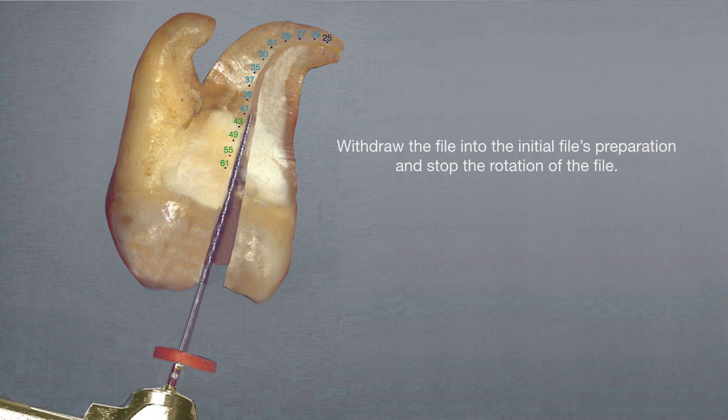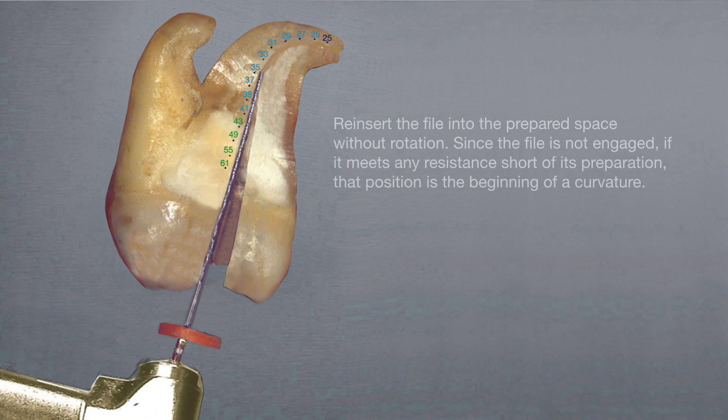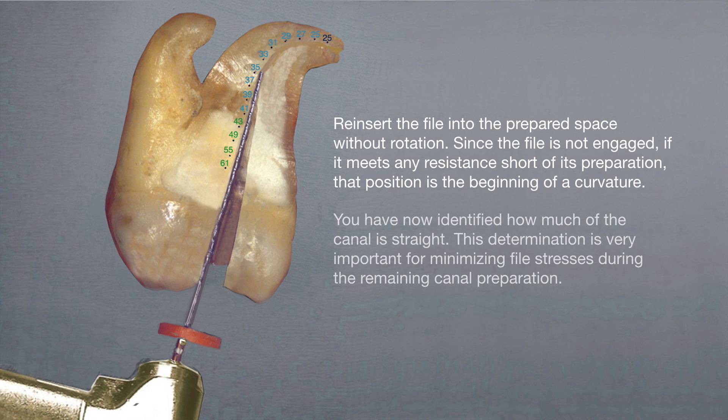Now withdraw the file into the initial file's preparation and stop the rotation of the file. Since the file isn't engaged, if it meets any resistance short of its preparation, that position is the beginning of a curvature.